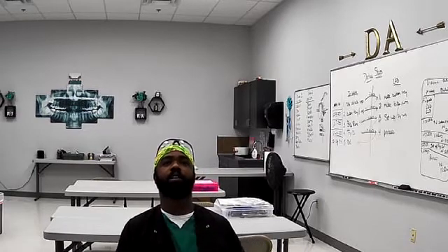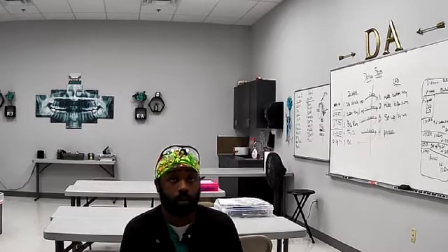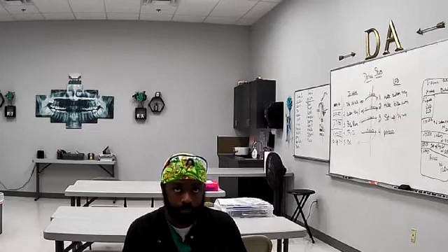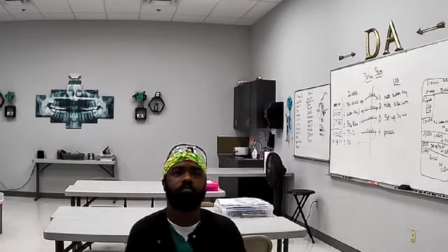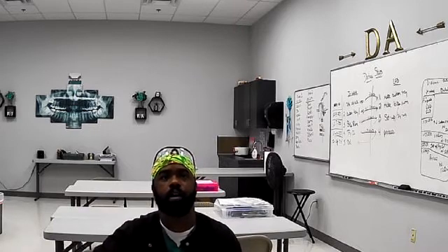However, full mouth X-rays are also often taken when your dentist suspects you have a jaw cyst or tumor. They're also used for significant dental work such as root canals, extractions, and gum disease treatments. You'll be asked to take bitewings and periapical X-rays during the FMX, of course. I already talked about that.